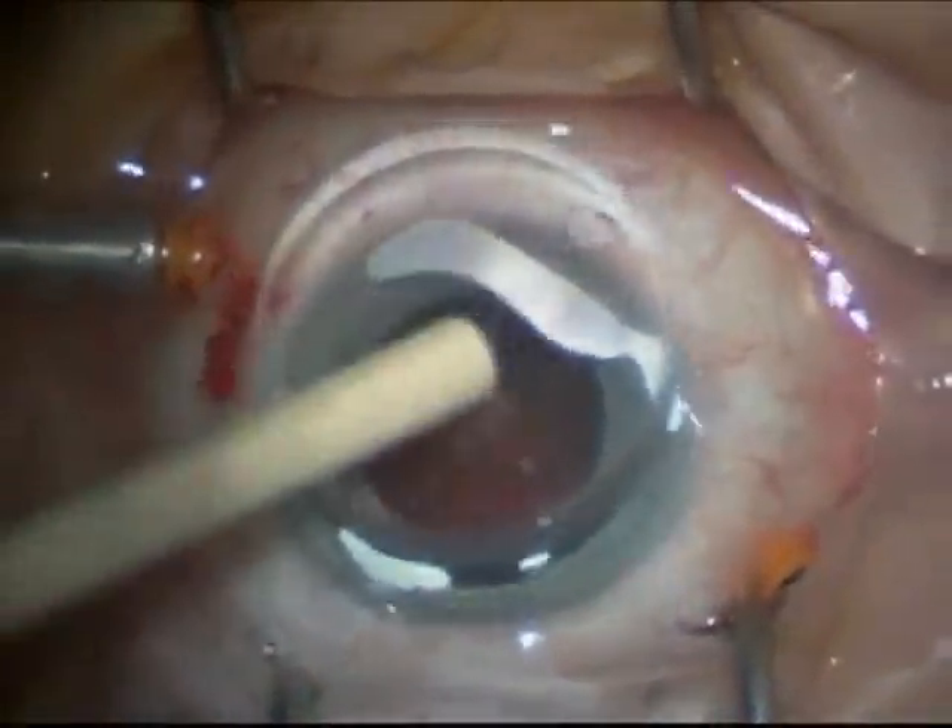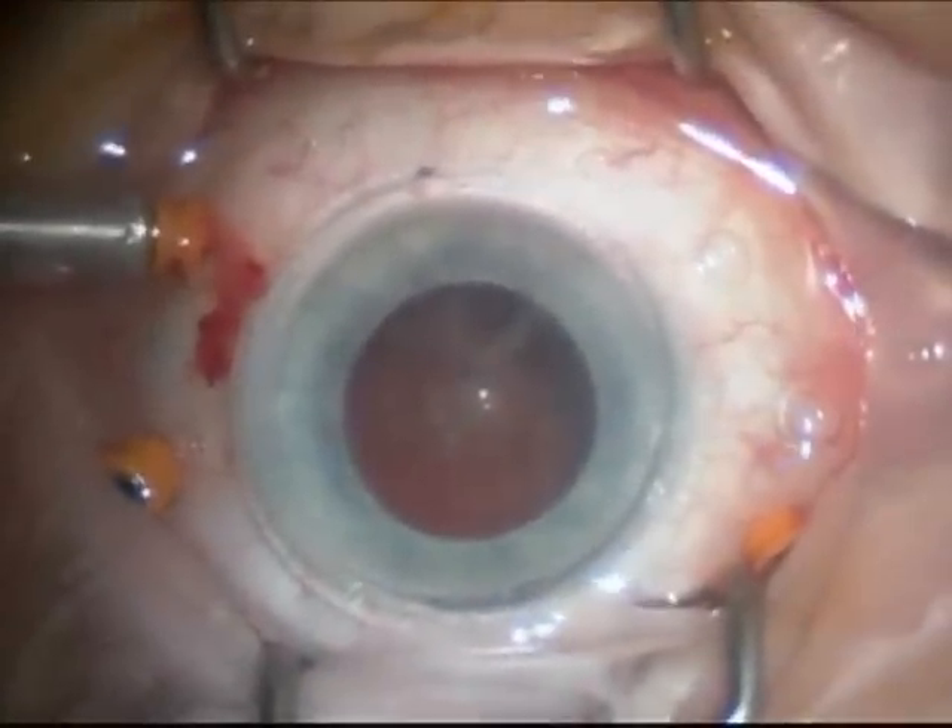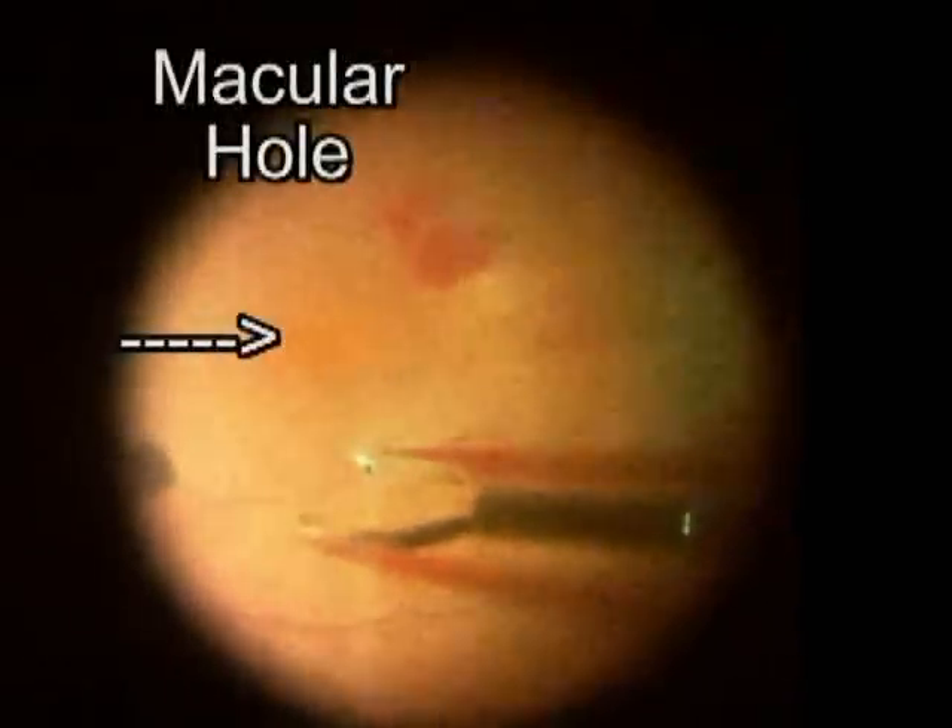Finally, we put a special contact lens on the eye to allow for high-resolution visualization of the macula. The next maneuver is removing the internal limiting membrane from the macula. The internal limiting membrane is a layer of the retina. These are specially designed 23-gauge forceps able to grasp the extremely fine membrane and pull it free of the retina. The membrane is attached to the vessels at some points, and as it's removed it's not uncommon to have a few superficial hemorrhages. You can see a few of those at the top of the picture. Here you see the membrane being pulled around the macula — it's best to peel it 360 degrees around the macular hole to allow the hole to close properly.